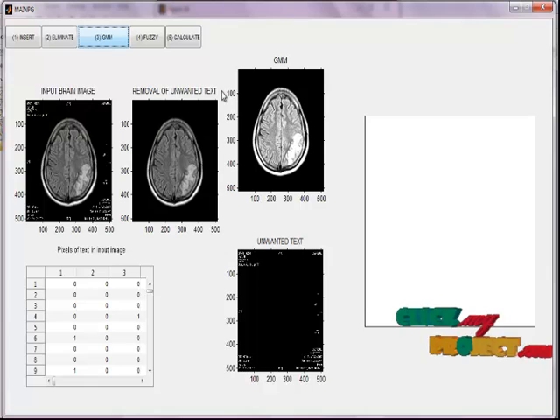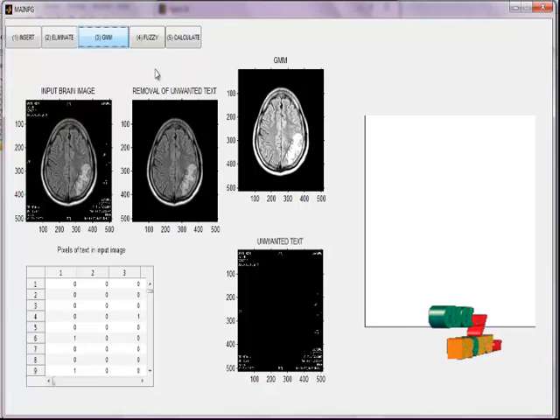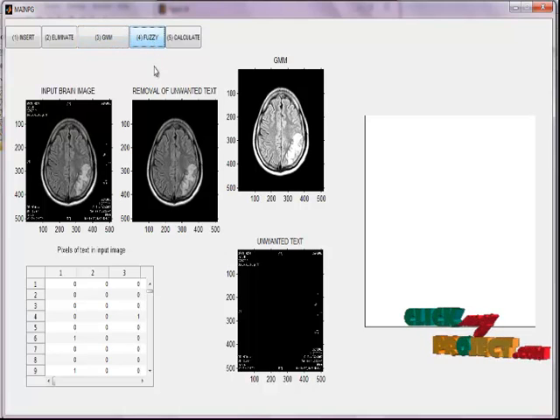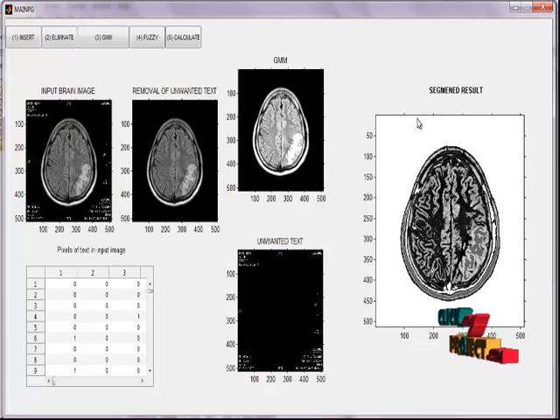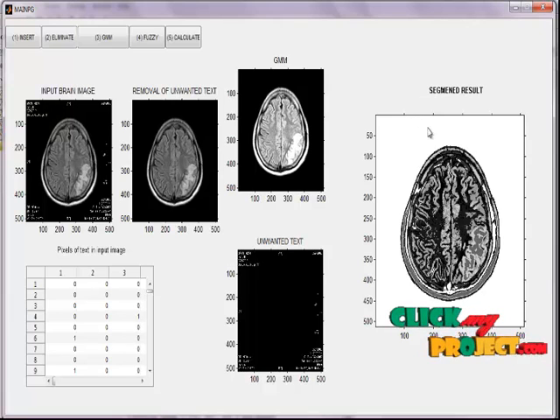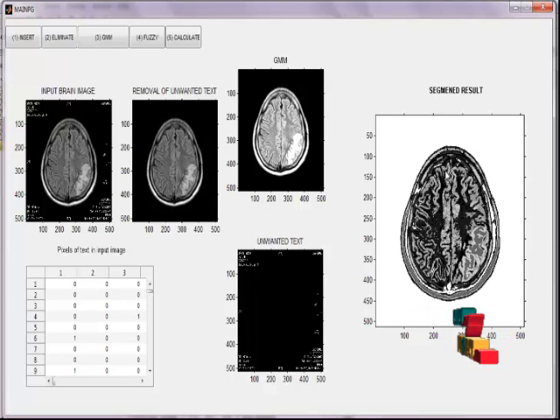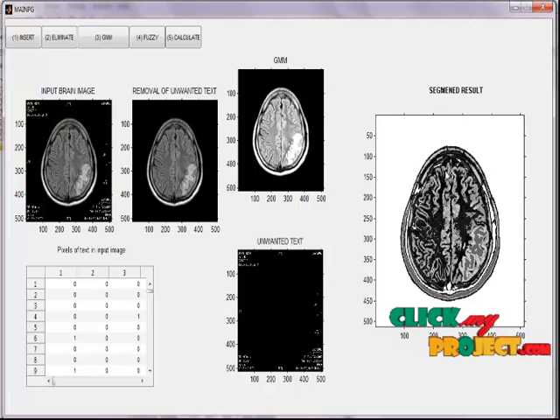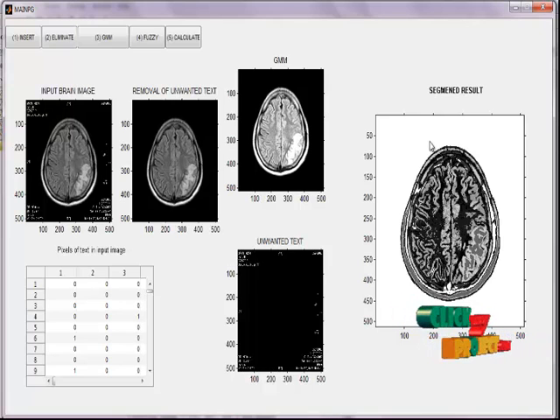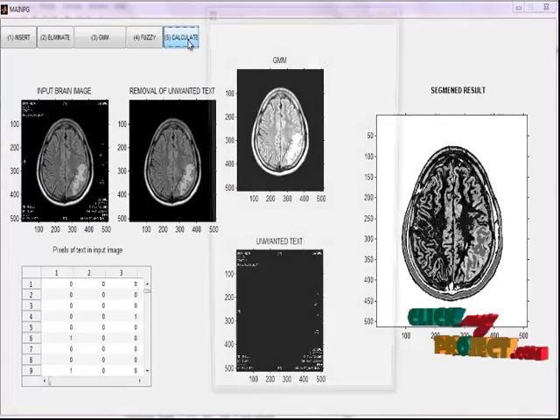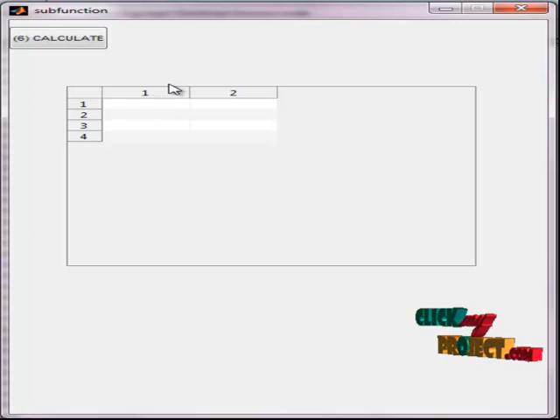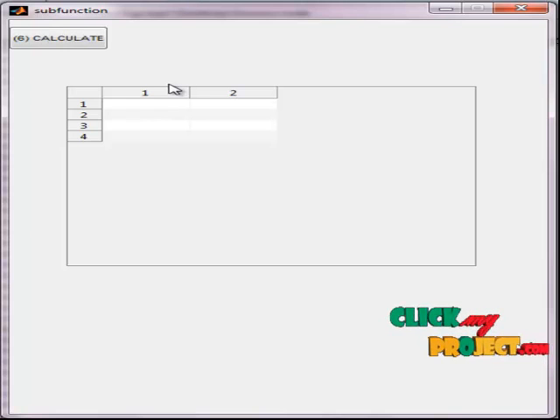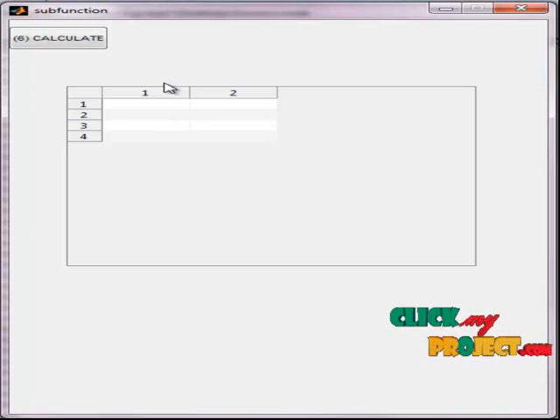These Gaussian mixes are given to Fuzzy to segment the given brain image. The segmented result shows the segmented brain image. This indexes both white matter and gray matter separately. After this, we calculate the white matter and gray matter by clicking the calculate button. In this step, we extract the labels of each gray matter and white matter pixel of the segmented result, finally finding the level of gray matter and white matter.